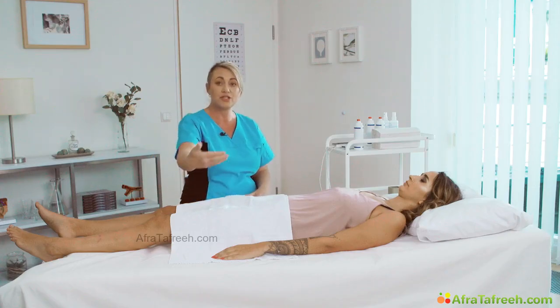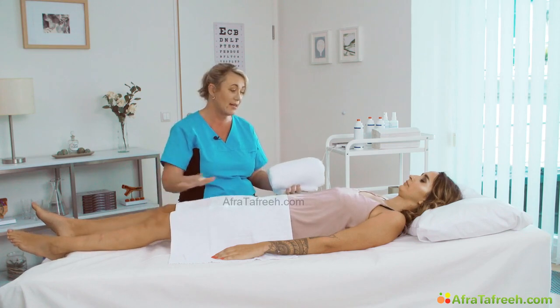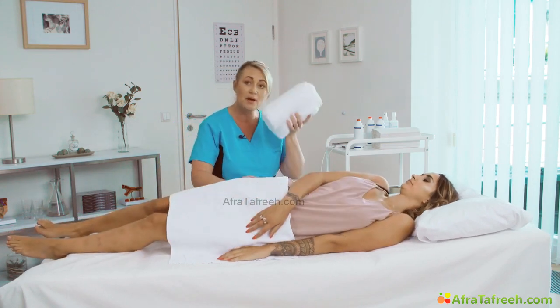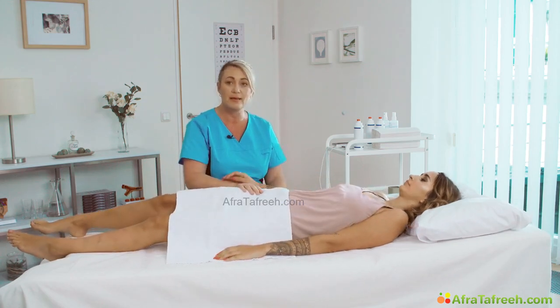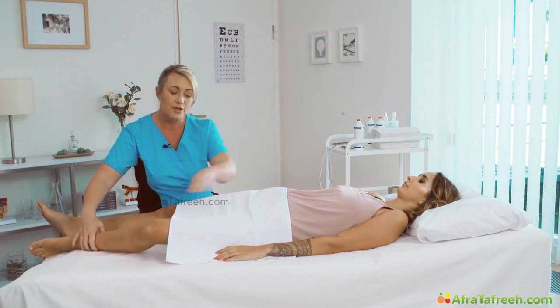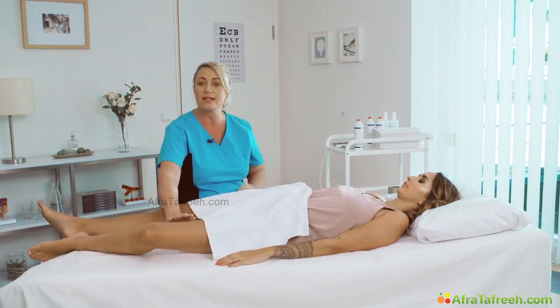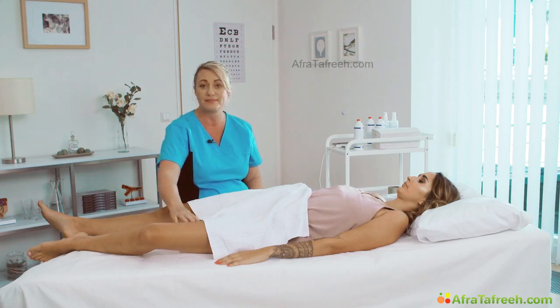We'll start with the patient obviously in the supine position, and we're going to ask the patient to roll slightly towards their affected leg, which in this case is the left leg. So we'll ask the patient to do that now, placing a little bolster under their hip and lower back just to rest and keep them comfortable. This position gives a natural external rotation of the leg in order for us to easily compress that femoral vein and make it a much more comfortable position for the patient.